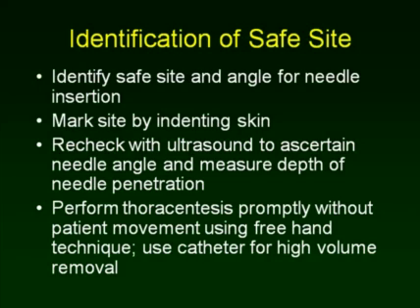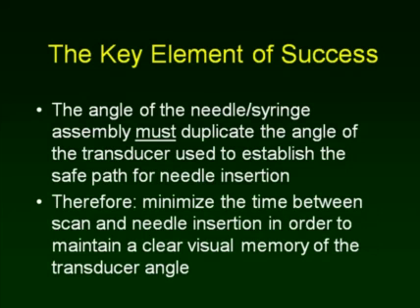The needle can be inserted using freehand technique, meaning it does not have to go under real-time guidance. And the needle may be used for simple thoracentesis, but obviously if there's any interest in a high-volume thoracentesis, safety requirement indicates a catheter insertion.